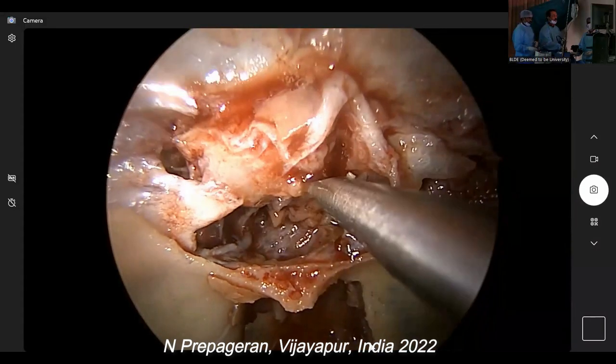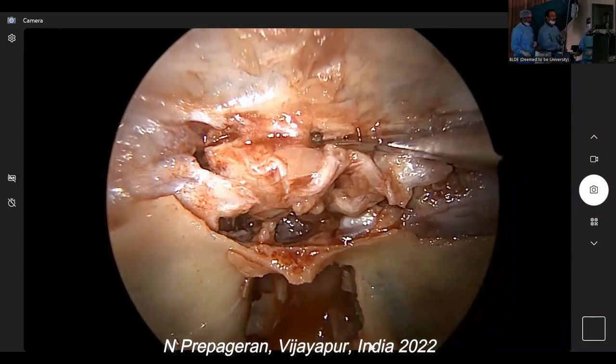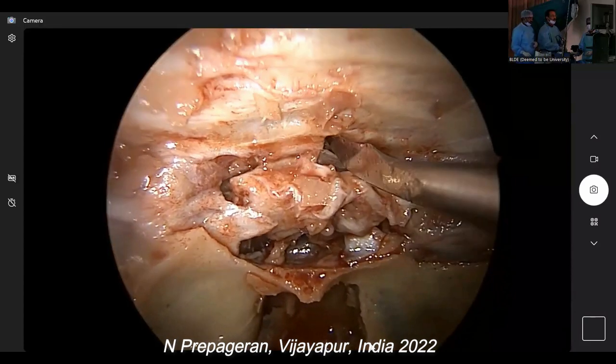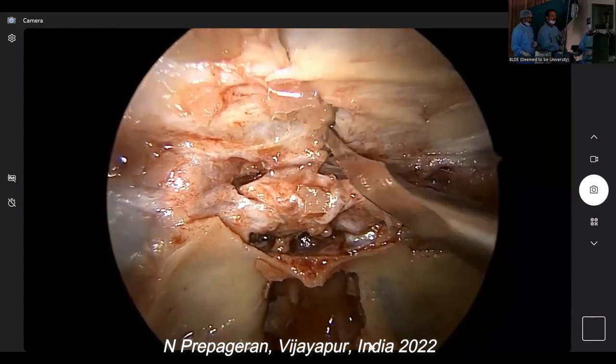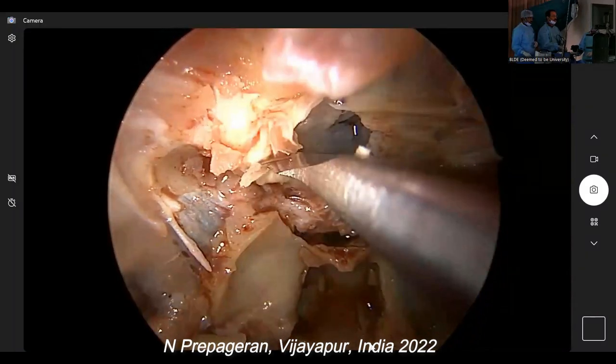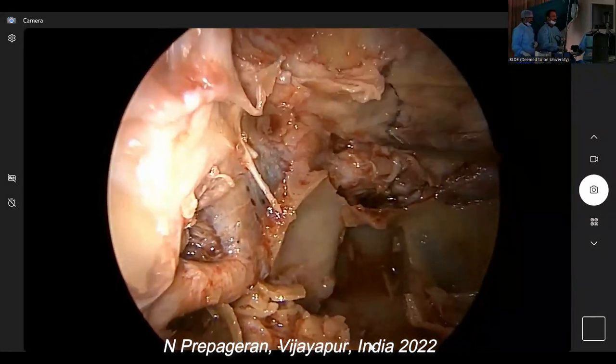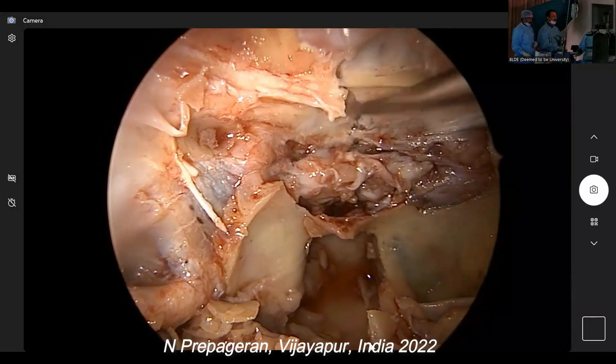Now, this is the upper third of clivus or clinoid. Okay. Now I'm going to open the suprasellar, transplanum. I can see the optic nerve coming into view. See, dura mater, how tough it is. Okay, that's the optic nerve. Can you guys see that?